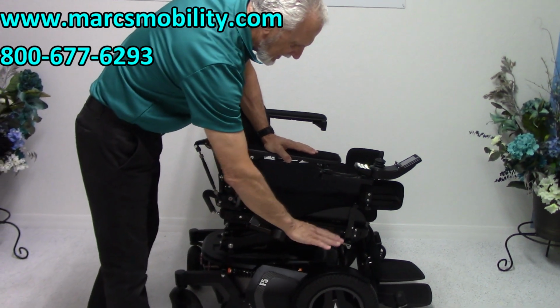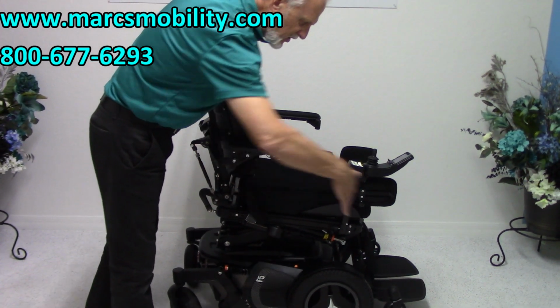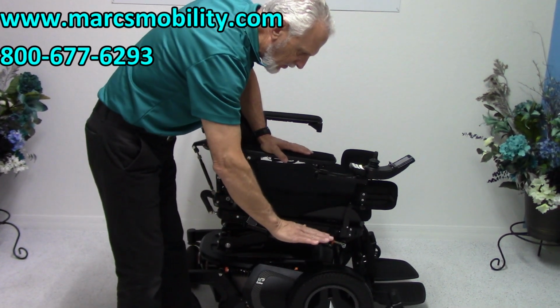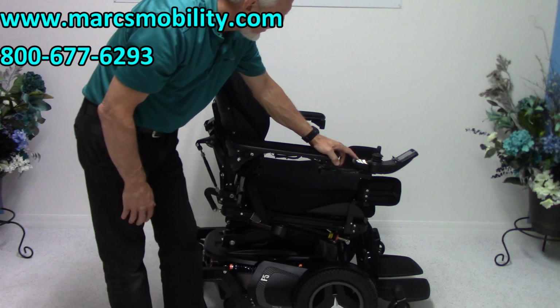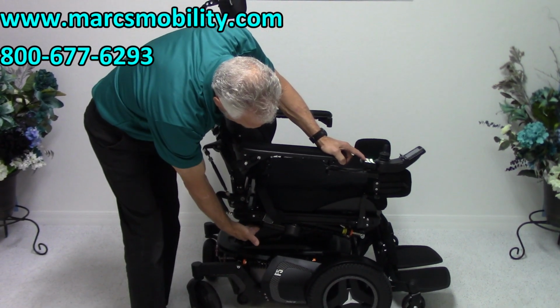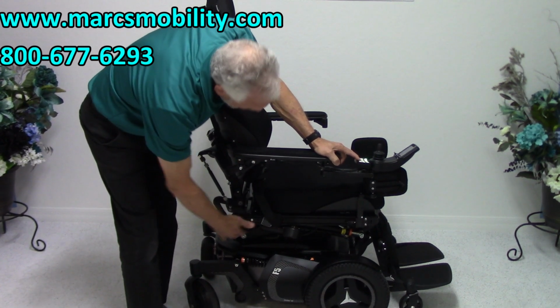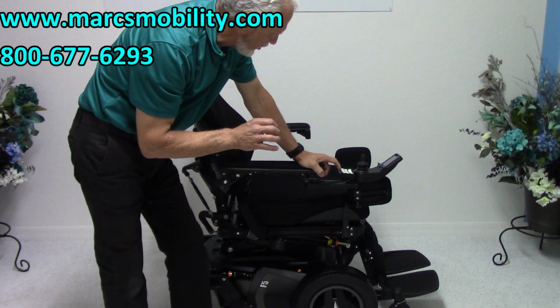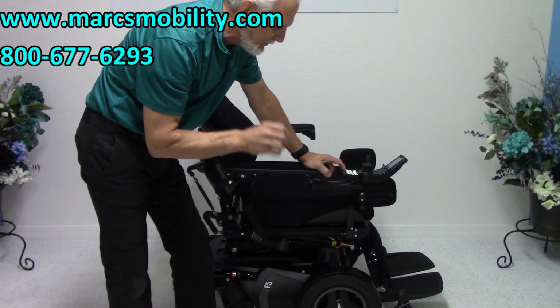You have to elevate the seat a few inches before you can tilt it. So if the seat's all the way down, it won't tilt. You have to elevate it a little bit and then it'll tilt. So I'm going to bring the seat back down to level position. You'll see it's going to come back to level. That's level right now. Okay, the last feature we're going to show you is called the standing position.